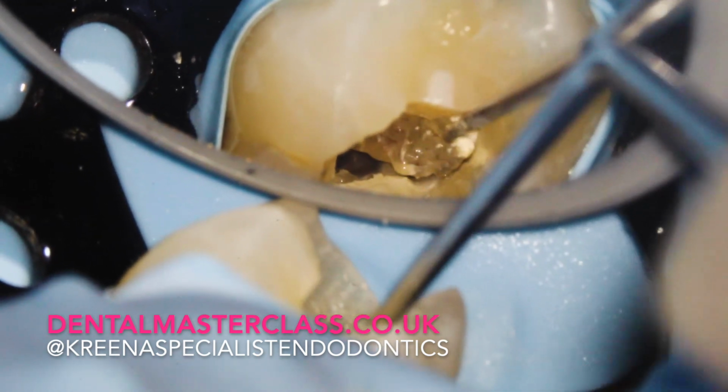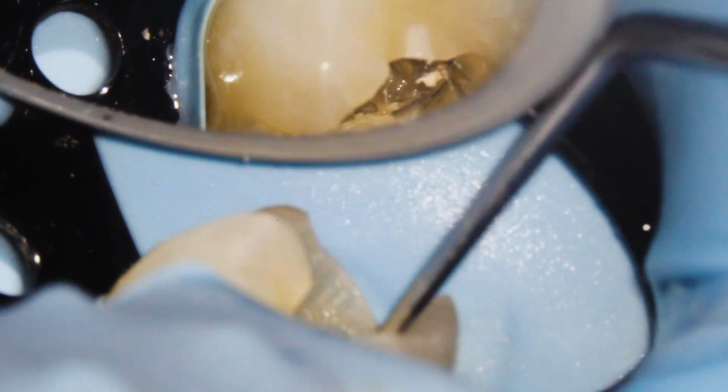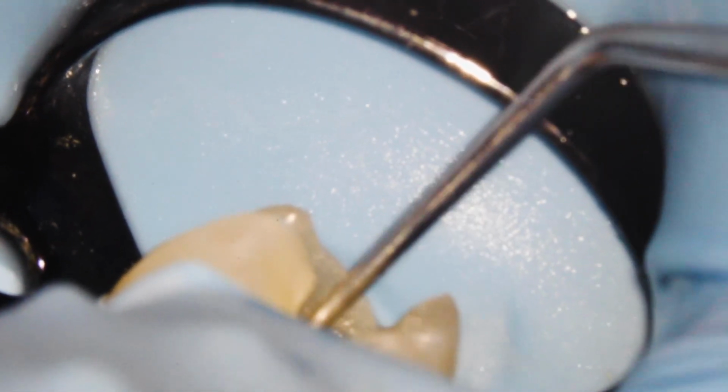Pulp stones sometimes occur if a tooth has had long-standing inflammation for a while, and the pulp tissue will tend to lay down more tooth tissue to protect itself, which makes root canal a little bit more difficult sometimes. So I'm just going to flick this out. We can see it coming out now.